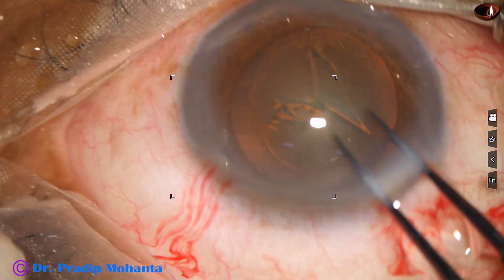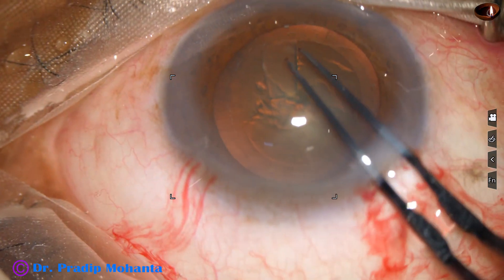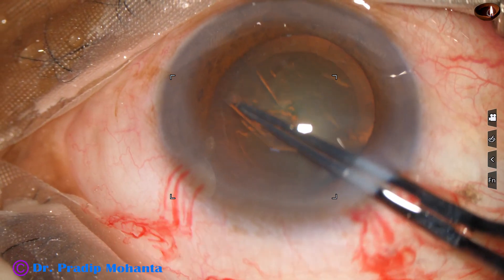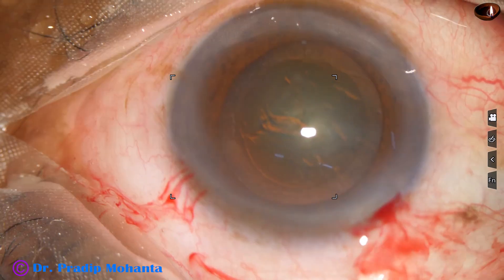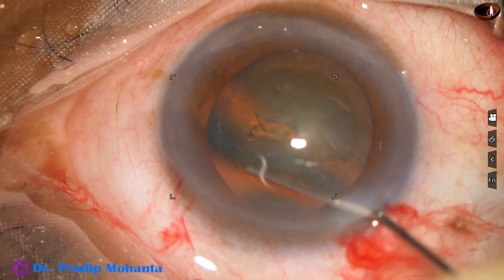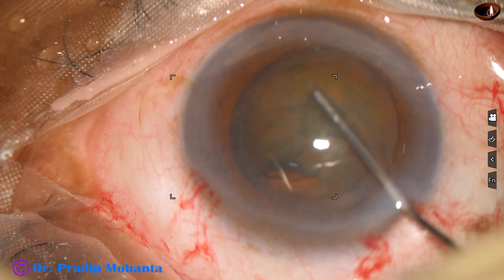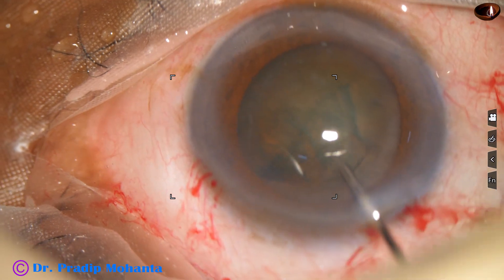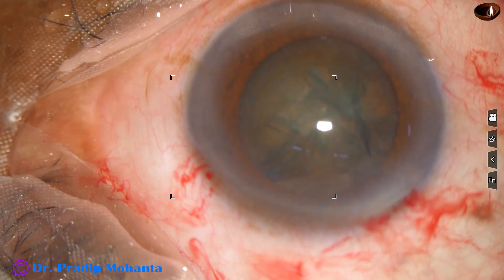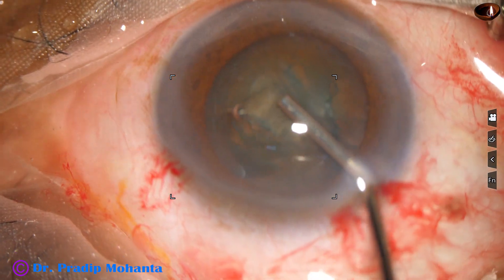Capsulorhexis is being done with the forceps. Size of this rhexis is about 5.25 millimeter. Hydrodissection is done. In this case, the zonule is a little weak, but not so much as we expect in cases with pseudo exfoliation.